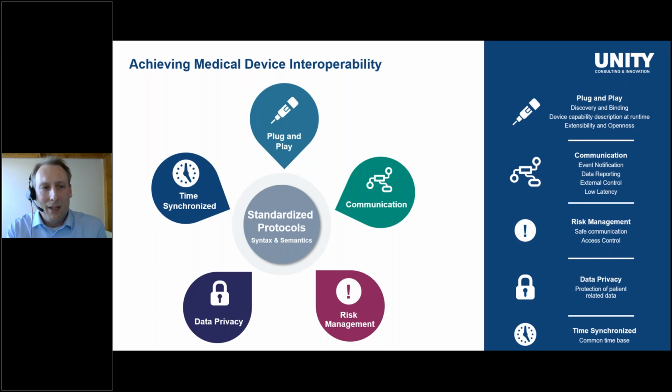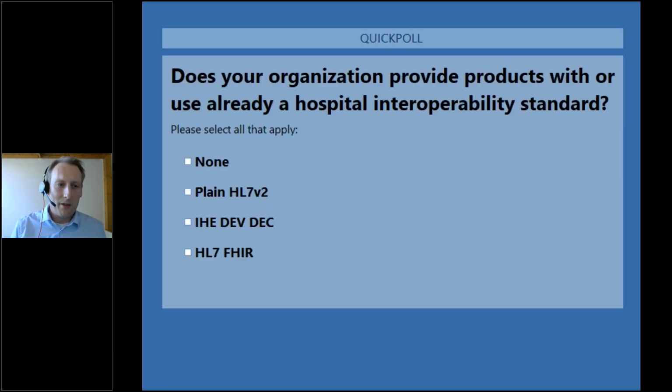If we later want to analyze the data, or if we want to have a synchronized display of ventilation data with patient monitoring data, time synchronization to a common time base is also needed. So now that we have more or less the key ingredients of such an interoperability protocol, I would like to know if you or your organization already utilizes an interoperability standard, or if you provide products having an interoperability standard.